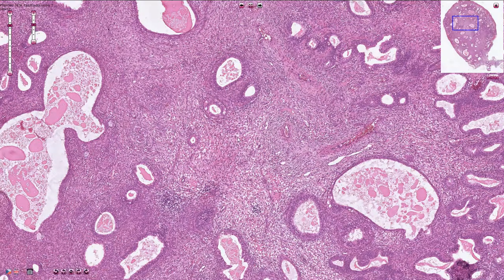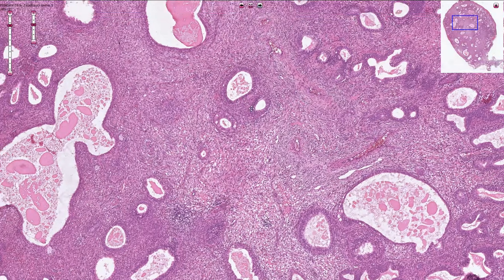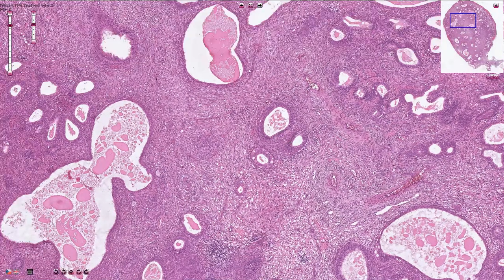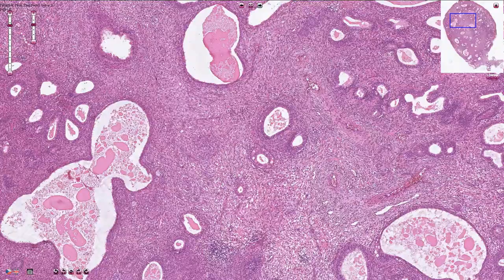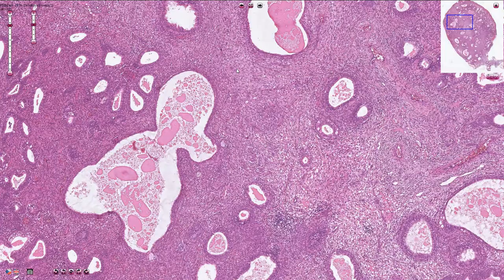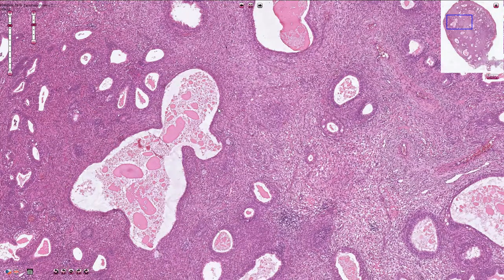In the endometrial stroma or fibrous stroma we see multiple endometrial glands, and most of them are slightly irregular. They can be dilated, irregularly shaped, and quite complex.